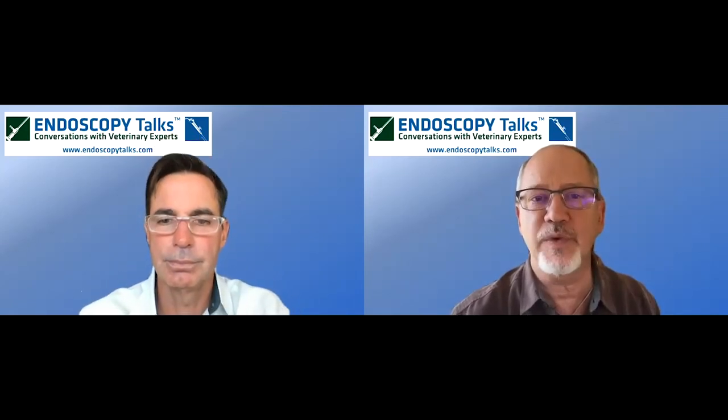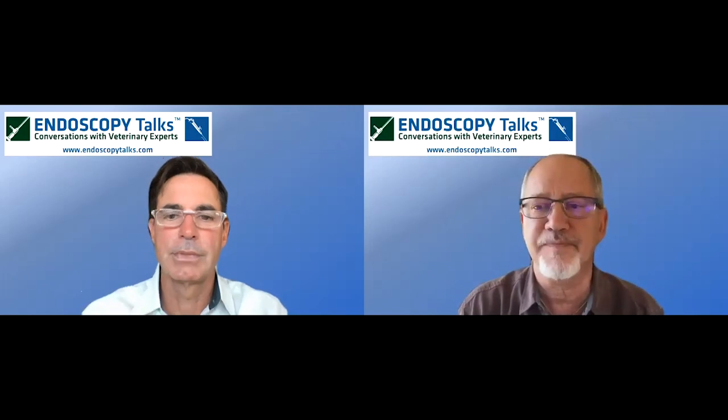First one, for a partial cranial cruciate ligament tear, what are your criteria for excising remnants? I've seen some surgeons leave it in place with the thought that it provides some rotational stability, but others will always remove the remnants regardless of how partial the tear is due to suspicion that free exposed edges will continue to contribute to inflammation. So as we saw in this presentation, those torn components resorb, and they usually resorb fairly quickly within about 2 or 3 months.